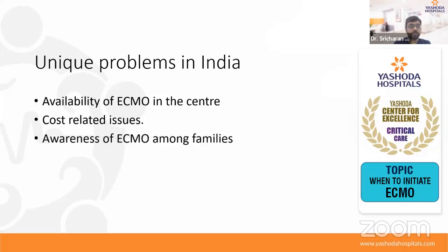And we also have to understand what the awareness of ECMO is among families. So when the patient is only hypoxic, and as previously discussed, ECMO is associated with its own set of complications. There might be bleeding complications, hemolysis, and infection in India is one of the major complications. So when we are discussing the complications of ECMO with Indian families, they might feel that probably this is doing more harm than good in patients with ARDS, where only hypoxia seems to be the concern.